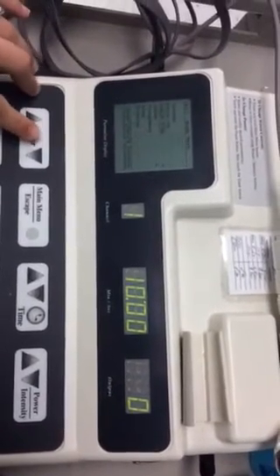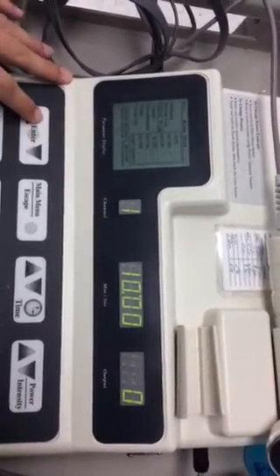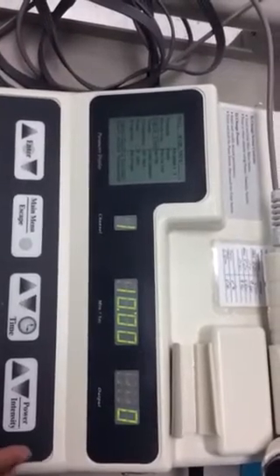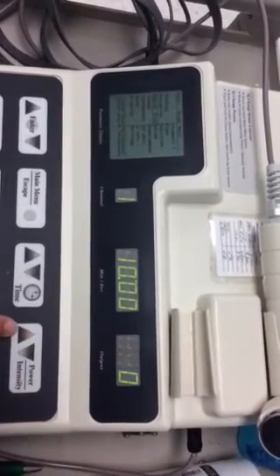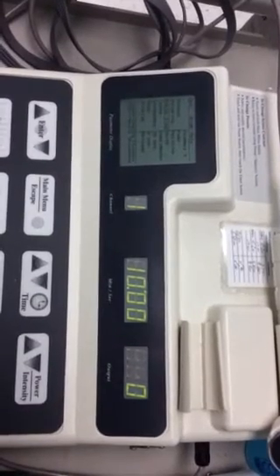And cycle time. Okay. Muscle contraction, you can use any of them. 10 out of 20, 10 out of 50, I tend to gravitate to those. So 1 every 30 seconds. Yes. And increase your power intensity until you get a muscle contraction, and press start.